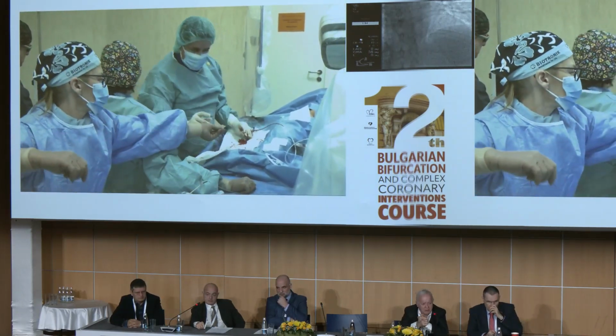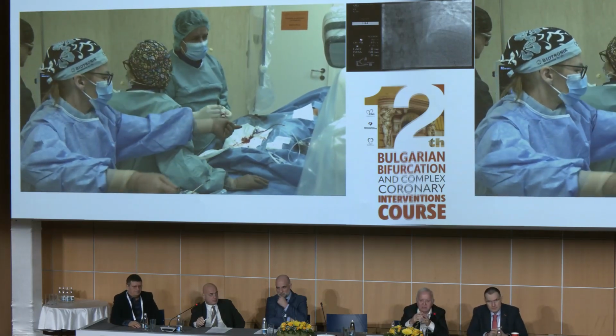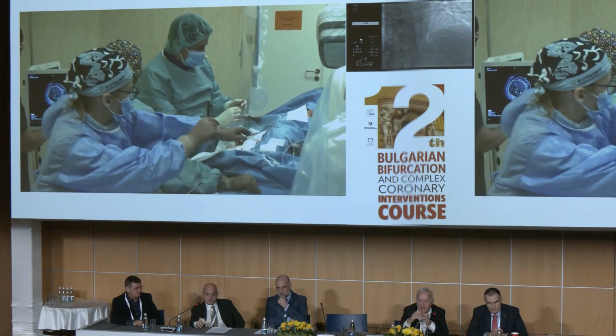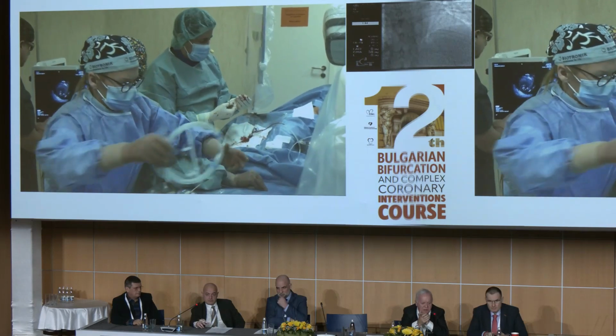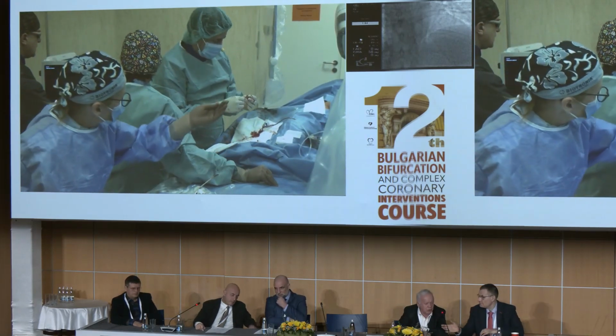So, you're going to measure the length? What we are treating is really the length, I guess, with lumen 12 all the way to 15, the same diameter as a true normal proximal diameter. This is the good target. So 40 will be too big for me.